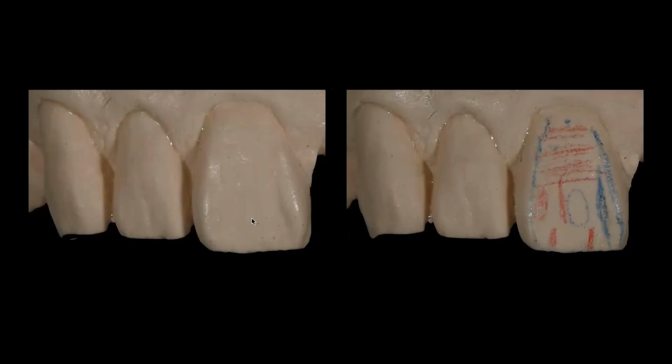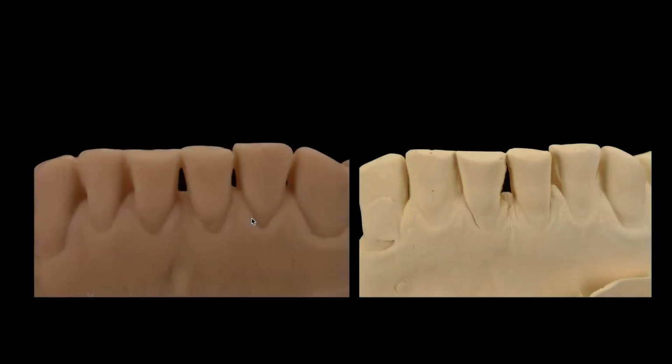So when I'm looking at something as deep or intense as this, I'm looking at all the things that we just went through. What are the ridges and grooves? What are the horizontals? Where are the pits and fissures that are in there? And is there a perikymata or not? As I look through those things, I'm trying to compare them to different models. And I mentioned to you that some of the challenges come in for us in this new modern world.